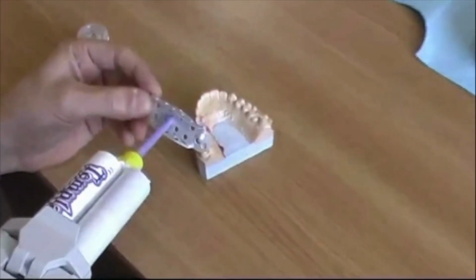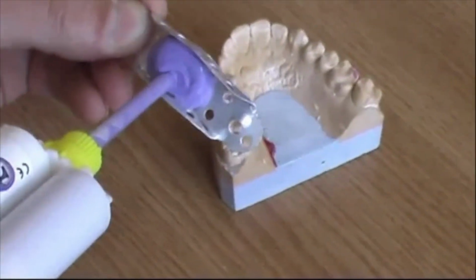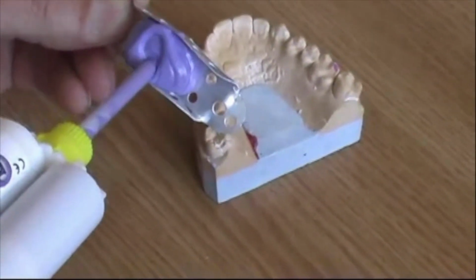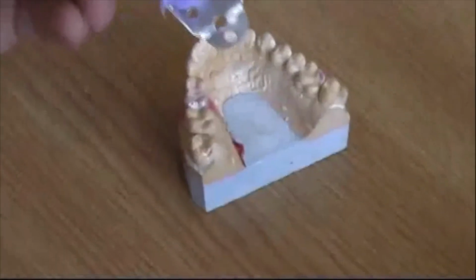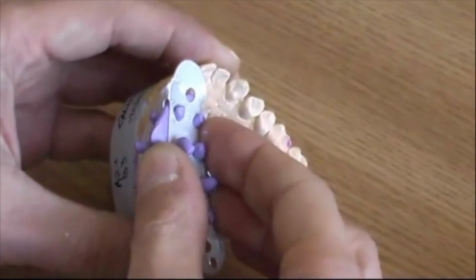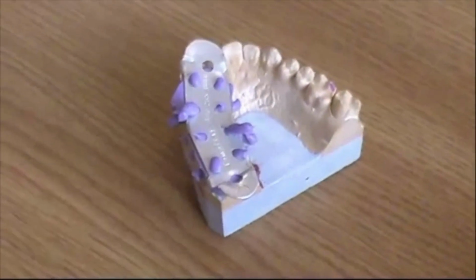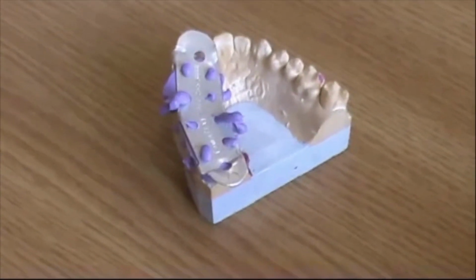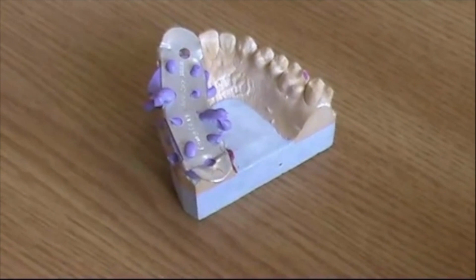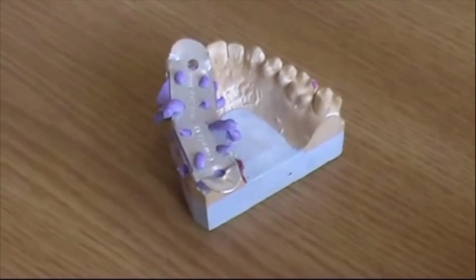And now we place this silicone to make an index. It's not a putty. We keep the tip in the material, and once we're done, quickly, there's no time to waste, 30 seconds set time. You just press it there. That's fantastic. That's the best way. Of course, it's more expensive than the putty, but the results, come on.